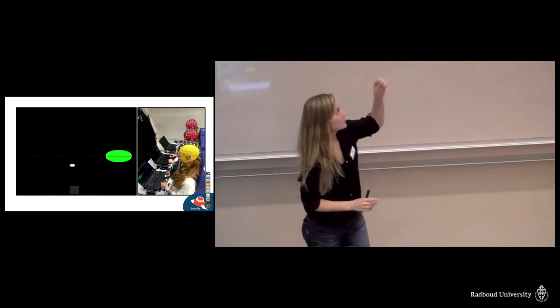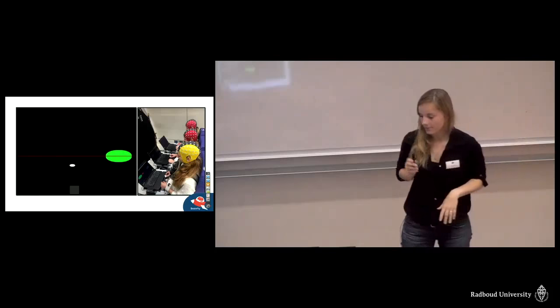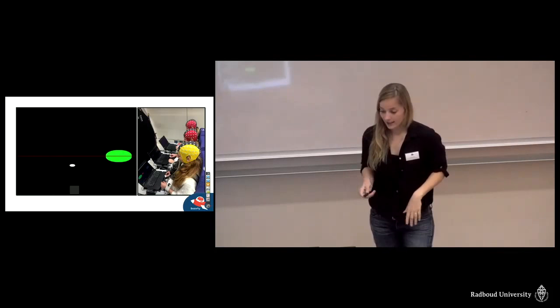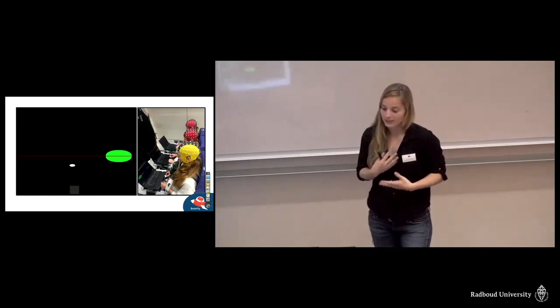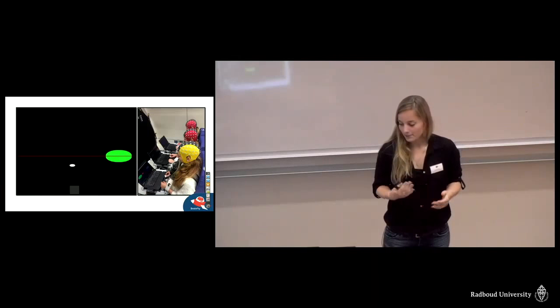So this is the setup on the right. We were placed in front of a dark screen to limit the noise and everything. And then we sat down in regular airplane seats, EEG cap on, the amplifier and everything belonging to the system was on the belly.